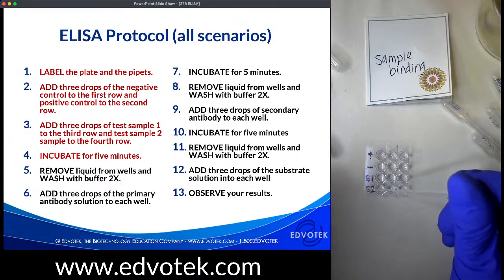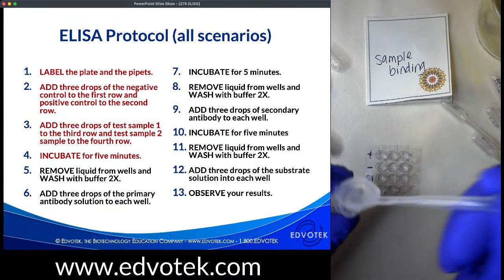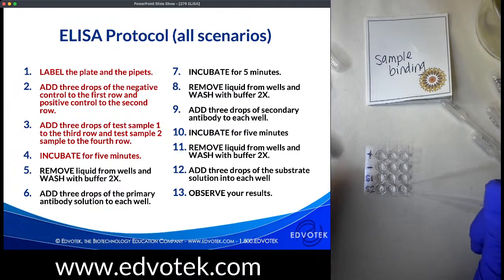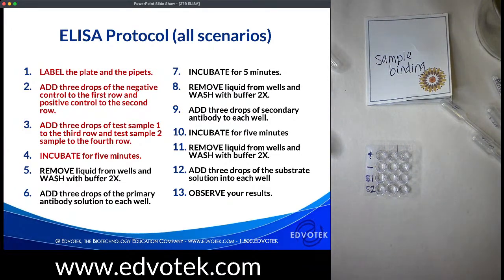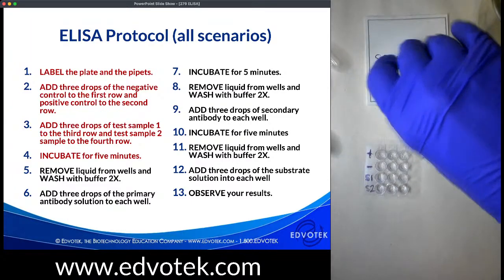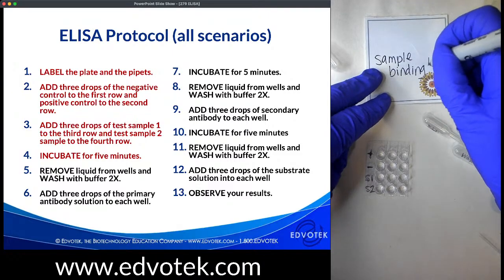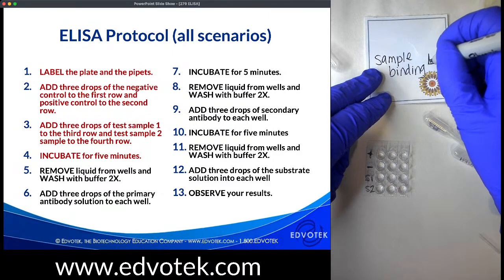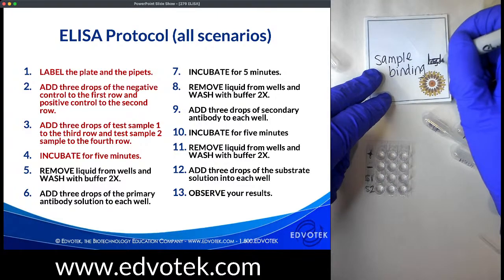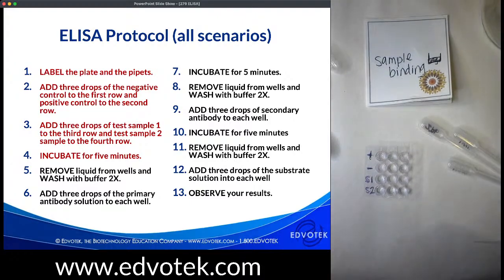So our 2 experimental samples, I know which one is going to test positive. You all do not. And so we will see by the end of this workshop where our antigens are in this plate. So right now, we're going to give this a few minutes to incubate. I'm just going to draw on a little bit of card real quick. What we've basically done is, here's our little individual well, and we are adhering our antigens in here. So these are our antigens, and let's talk about what is actually happening in this well right now.